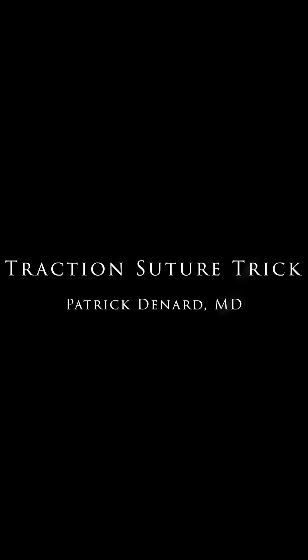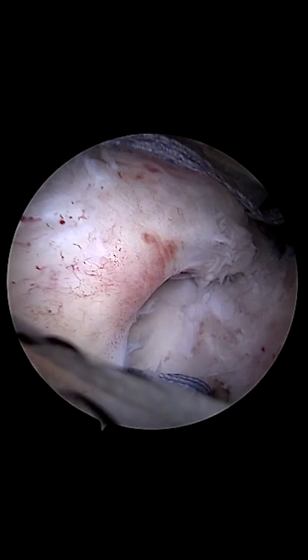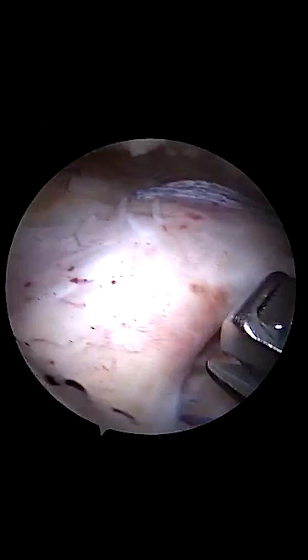This is a simple trick for use of a traction suture during reduction of a rotator cuff tear that's under tension. There's a right shoulder with a crescent-shaped tear, and you can see already there's going to be some moderate tension on this cuff.